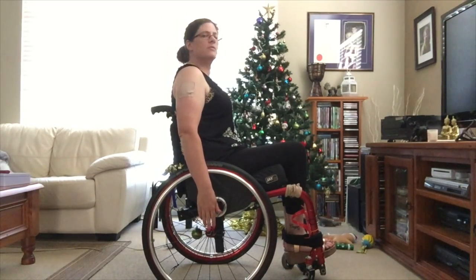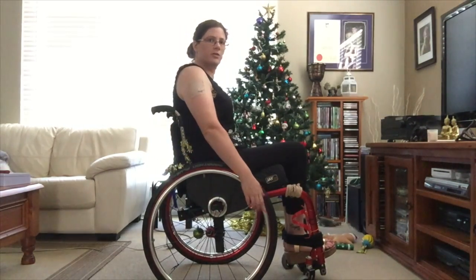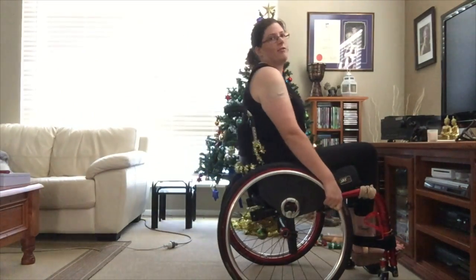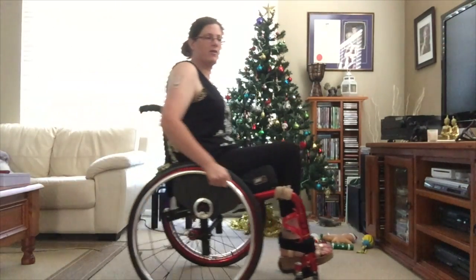So that way when you push, your arms will be going from 10 o'clock to 2 o'clock. That is your most efficient way of pushing.